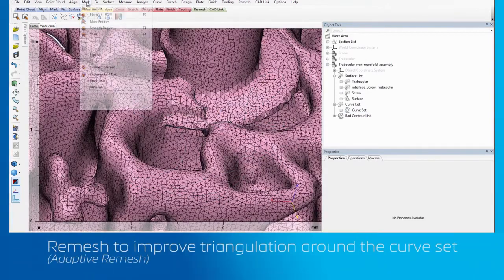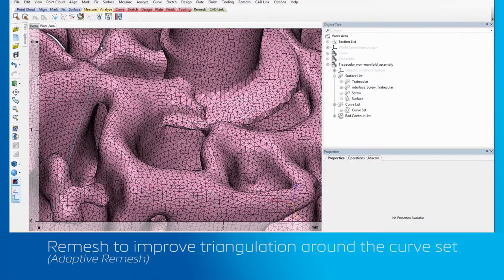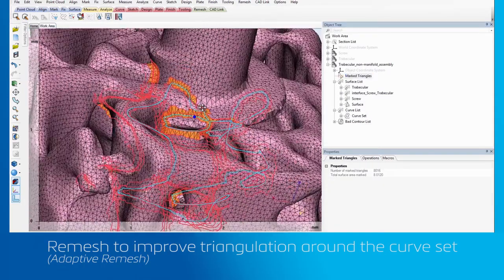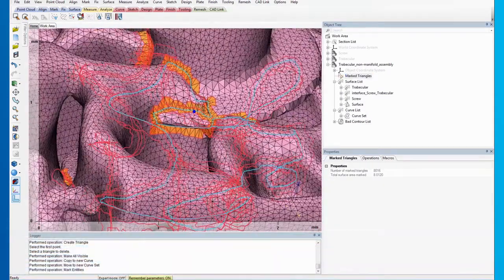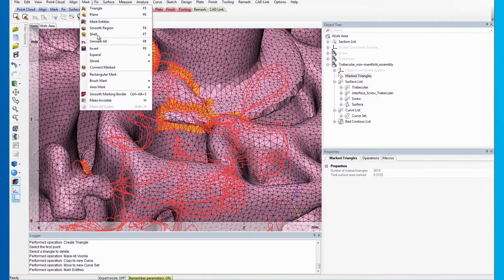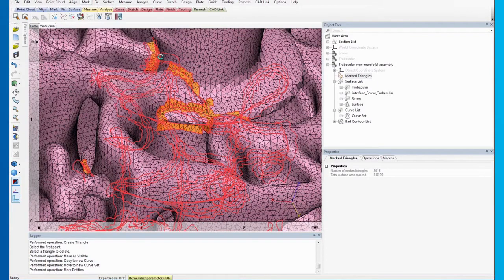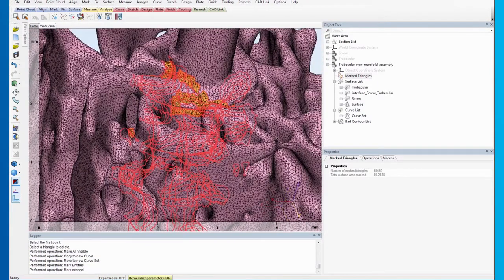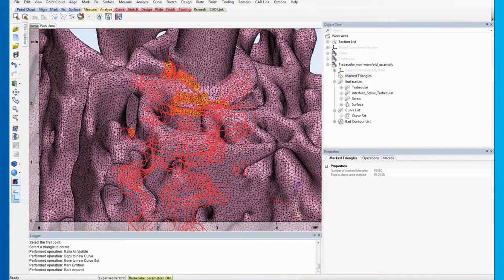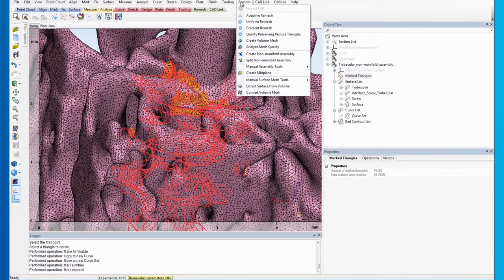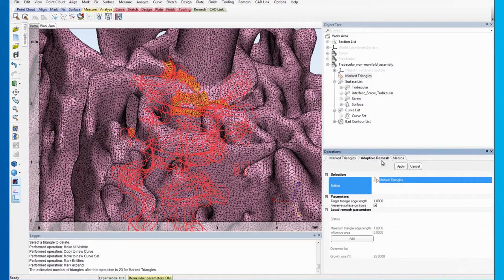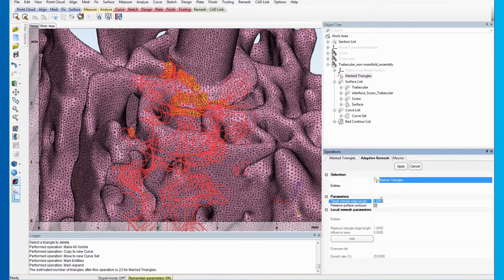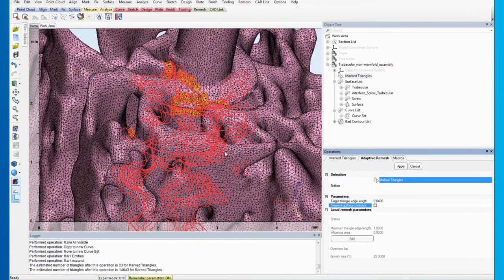To remesh the area, we select the newly created curve set. Now, we can see that the area of the curve is marked. Next, we expand the marked areas by selecting Expand operation. The next thing we need to do is to remesh the marked areas. Go to the Remesh menu and click on Adaptive Remesh.